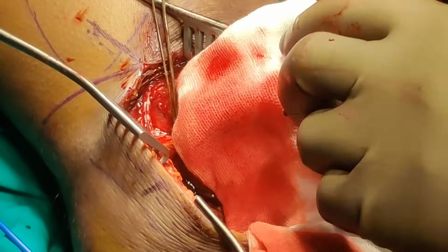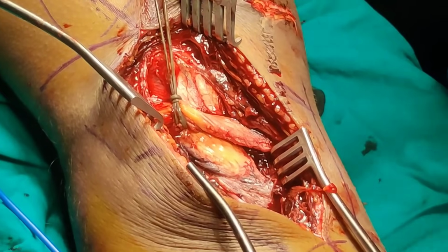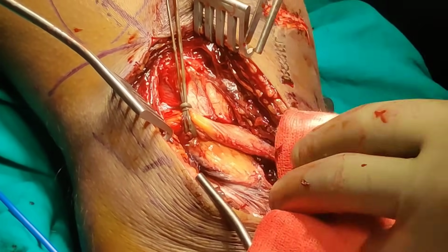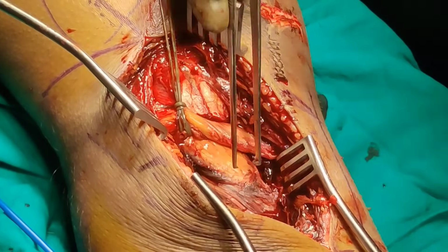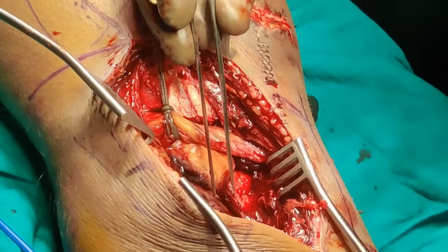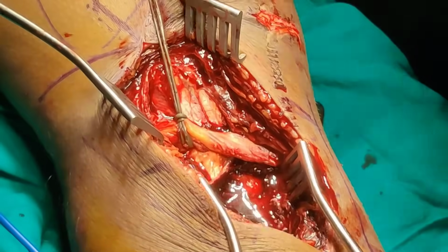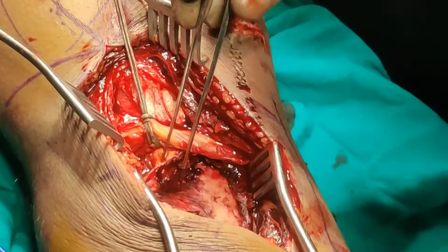However, I feel it's unnecessary, and I don't open the joint, especially on the medial side. Lateral side, yes, always, because lateral side is the weaker side. You see a lot of comminution. Medial side is the stronger side. The articular surface is usually not comminuted, so I don't see any point in opening the joint and adding to the morbidity. So I'm just lifting this up, and then if I reposition this, I can start seeing the fracture site.